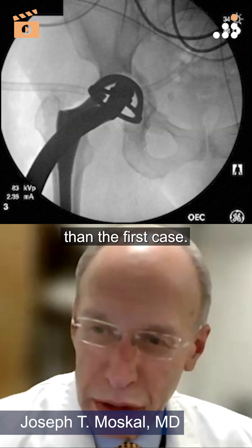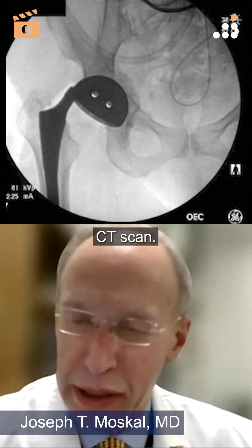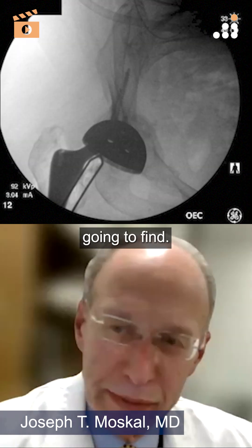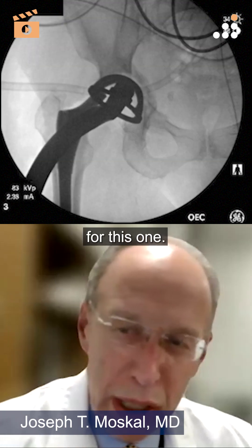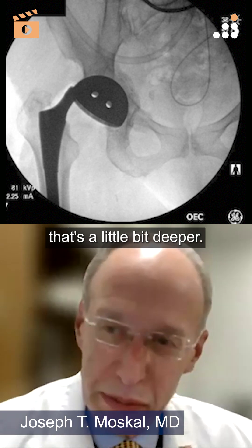This is a different animal than the first case. I wouldn't get any preoperative CT scan for this case — I feel comfortable, I know what we're going to find. I would use a revision component that's multi-hole and a little bit deeper.